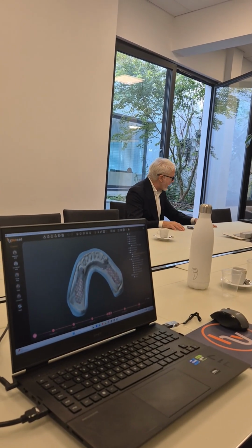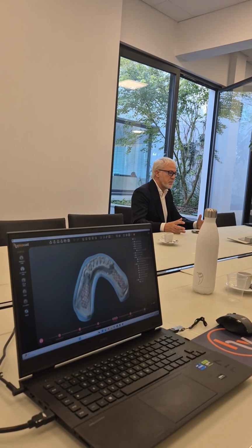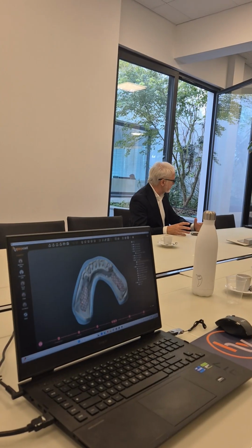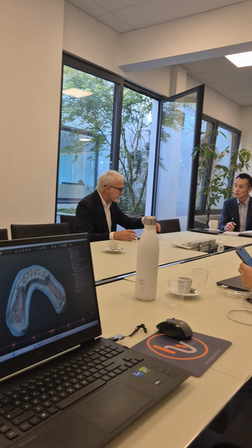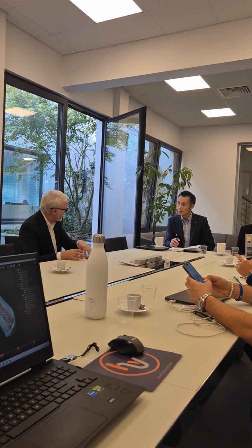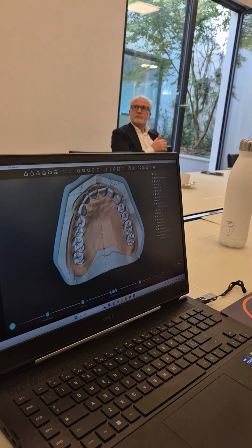And that's the reason why, if you think that you have to pay more than 10,000 euros for a single license of ExoCAD right now, this is something not affordable anymore for this market. This market cannot afford to buy the software. That's the reason why there are tons of cracked licenses of ExoCAD, which is illegal.